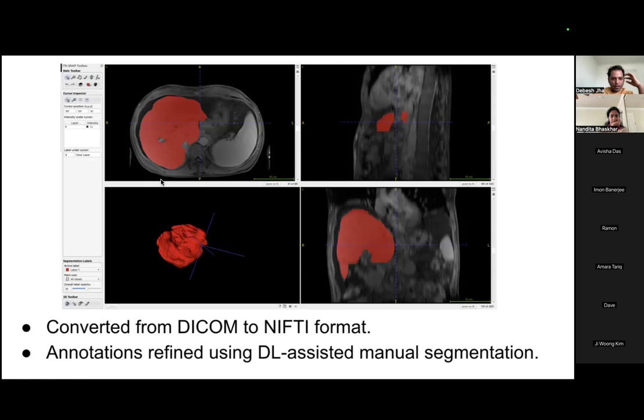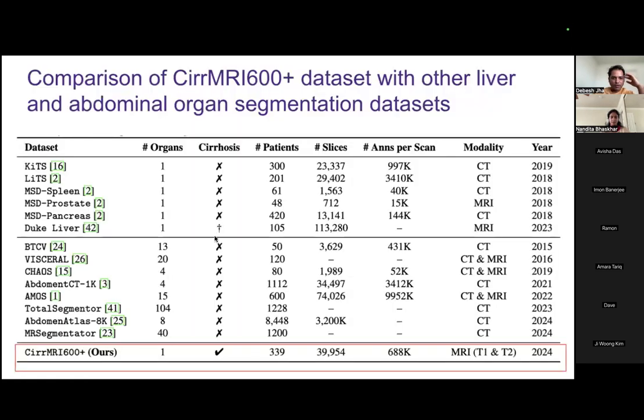First of all, we get DICOM images. These are some of the information related to pre-processing DICOM images. Then we anonymize all the information, for example scanner type, patient age, everything like that, and convert it into NIfTI format. Then we use deep learning based methods, for example TotalSegmentator or our own algorithm, to get a segmentation, and then we send this to the doctor, so at least we can save some amount of time while annotating the data set.